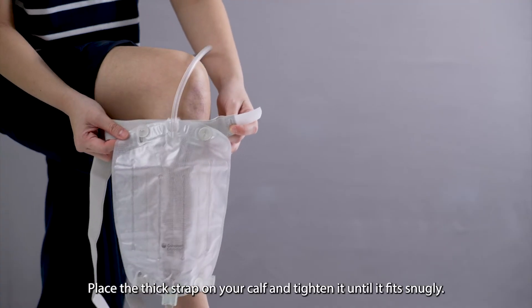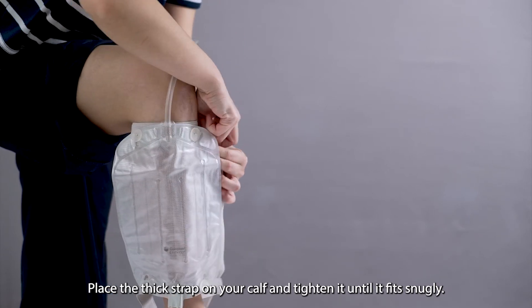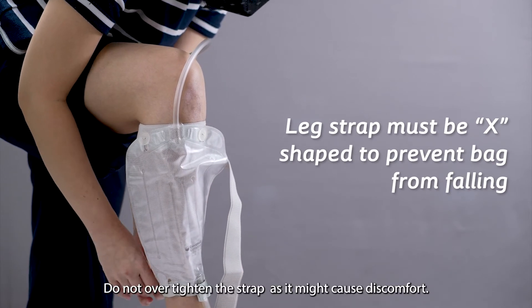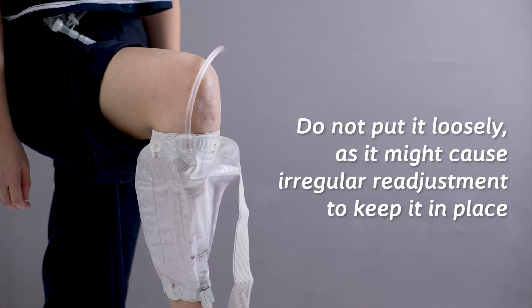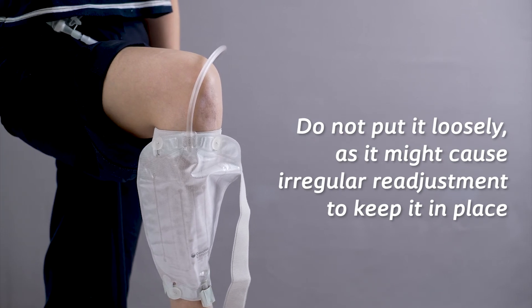Place the thick strap on your calf and tighten it until it fits snugly. The leg strap must be X-shaped to prevent the leg bag from falling. Do not over tighten the strap as it might cause discomfort, and do not put it loosely as it might cause irregular readjustment to keep it in place.